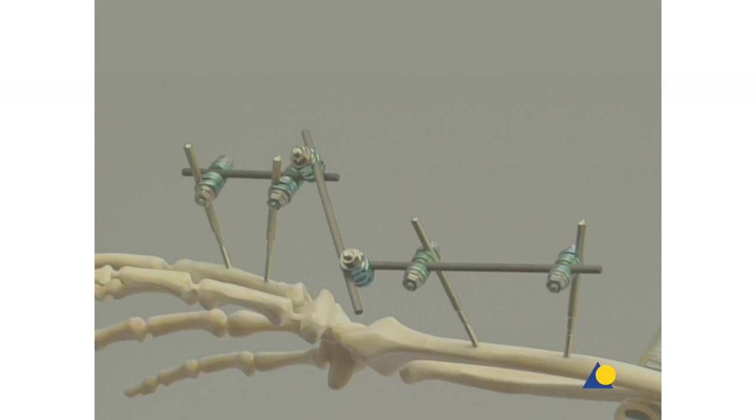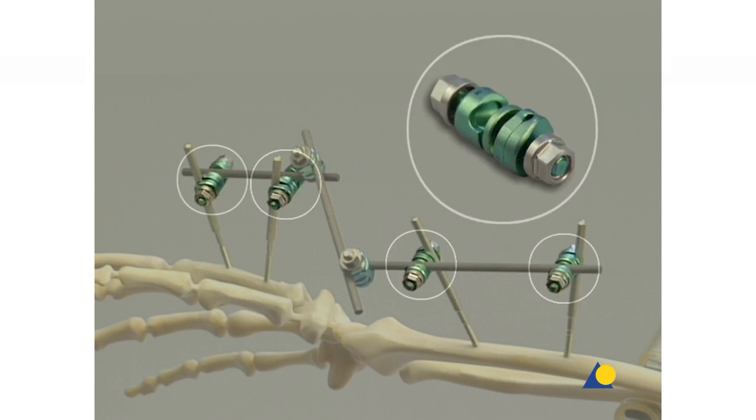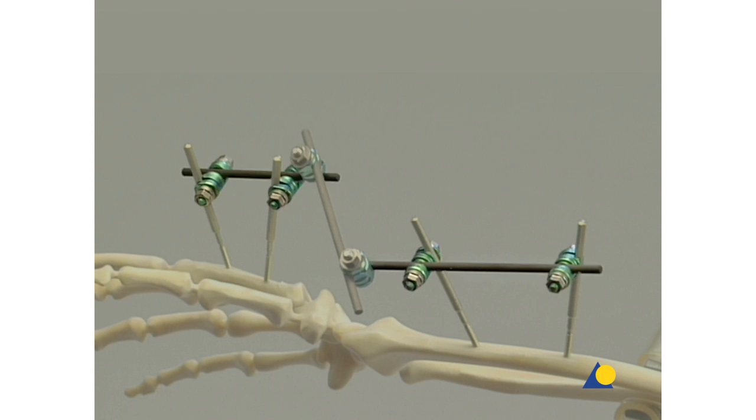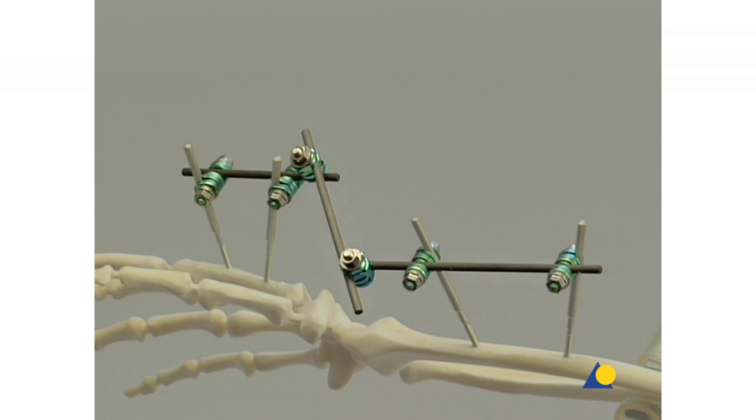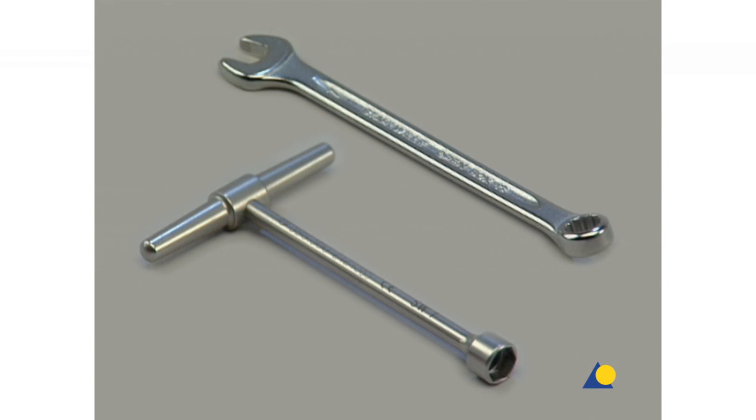The construction of the bridging frame requires four MR-safe self-holding clip-on clamps, two 4-millimeter diameter connecting rods, two MR-safe self-holding clip-on combination clamps, and one additional 4-millimeter diameter connecting rod. To tighten the frame assembly, the 7-millimeter socket wrench and the 7-millimeter combination wrench are needed.